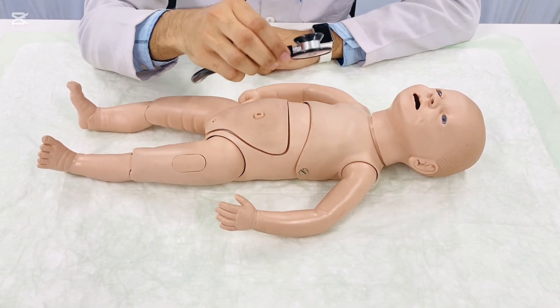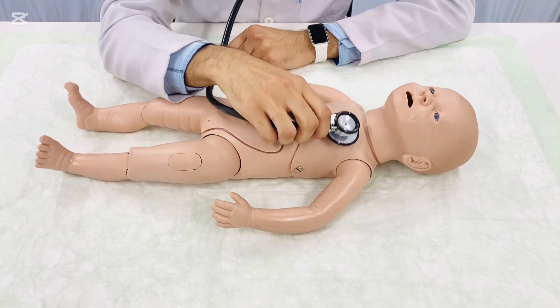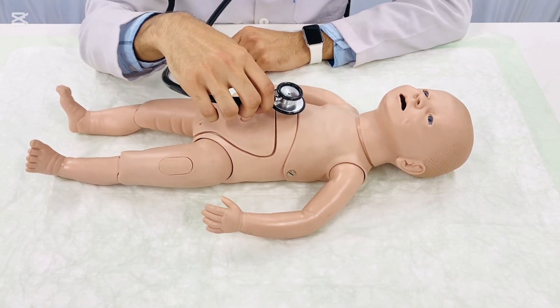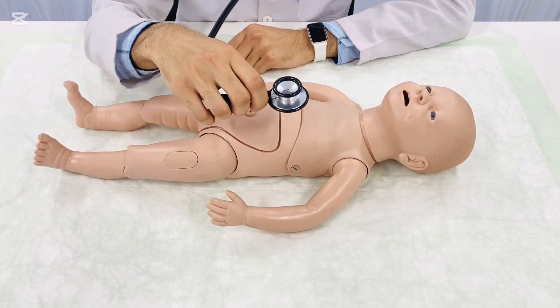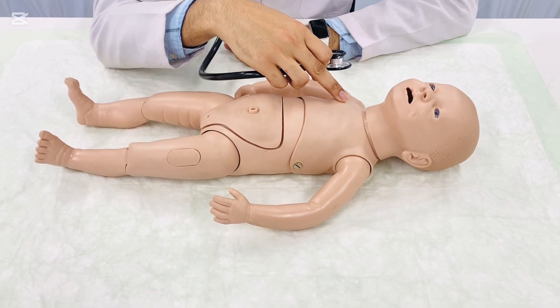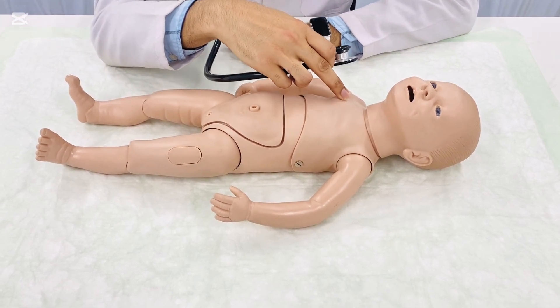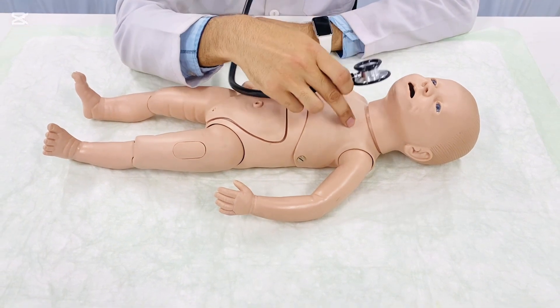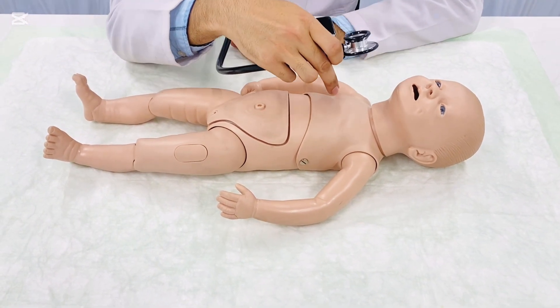In the next step, we will place the diaphragm in a symmetrical manner, not asymmetrical. For example, if we are placing the diaphragm first in the right infraclavicular region, then we will place it in the left infraclavicular region. This is the symmetrical pattern.